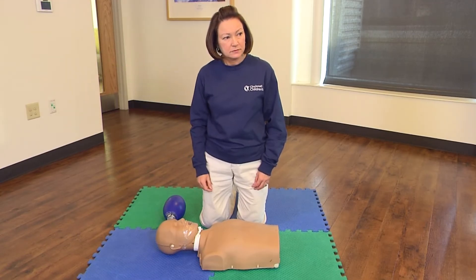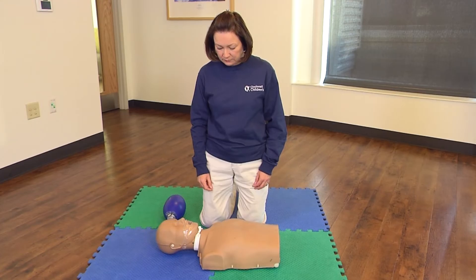If the adult is lying on their stomach, turn them over onto their back. They should be lying on a hard, flat surface.